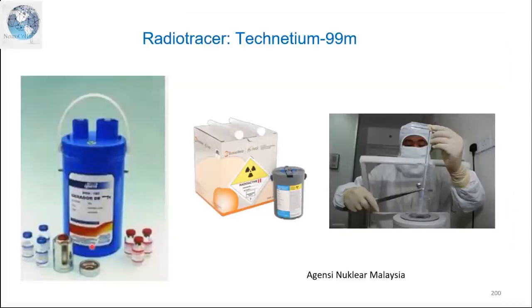Okay, so this is how they take out the technetium from the technetium generator. So technetium you can buy the generator, it will be delivered to you. Okay, so this one you can use it for maybe 1 to 2 weeks depending on how much volume of your patient. So dia tahan. Dia ni macam satu peti sejuk yang ada storage. Okay, kamu boleh tarik je berapa banyak kamu nak untuk digunakan untuk patient setiap hari. So dia tahan selama 1 atau 2 minggu. Lainlah macam F18 kena beli setiap hari. Sebab lepas 2 jam dia dah hilang dah dia punya energy tu.